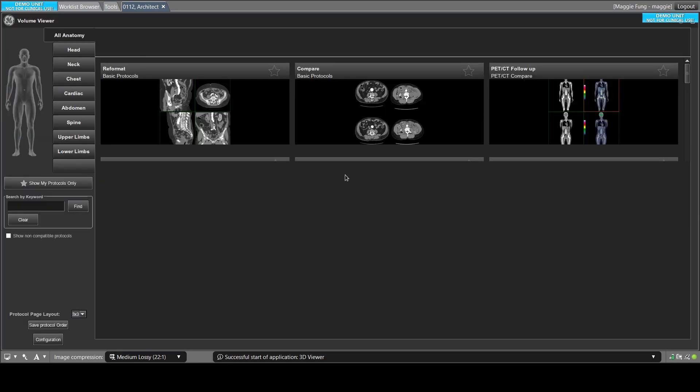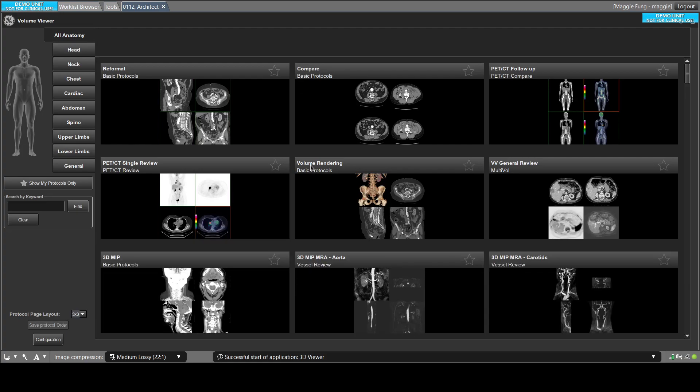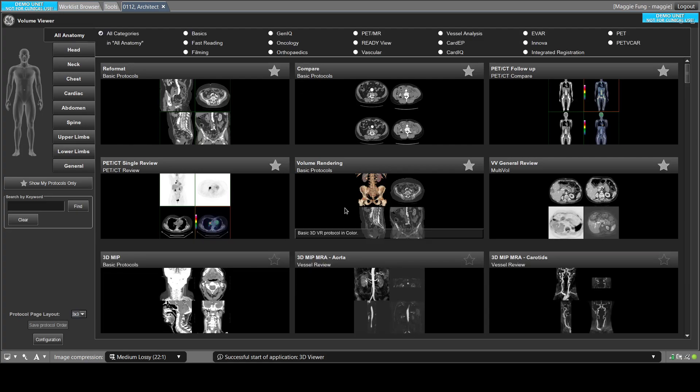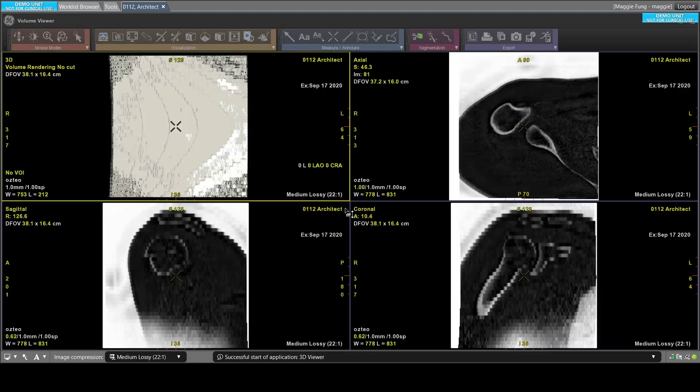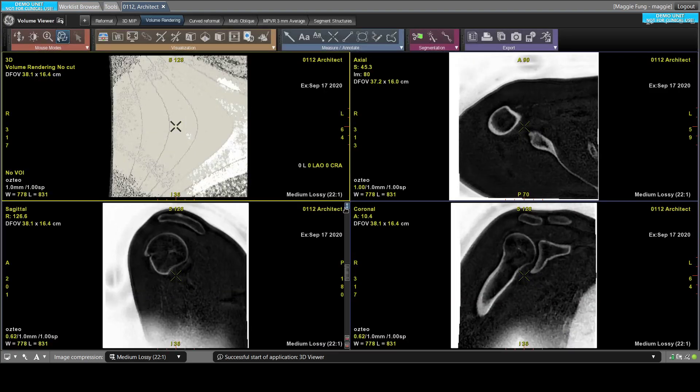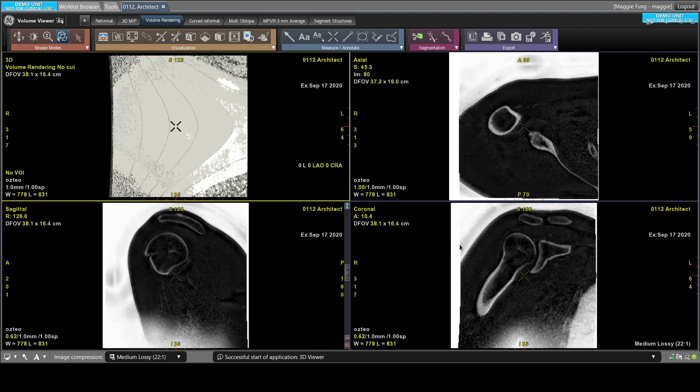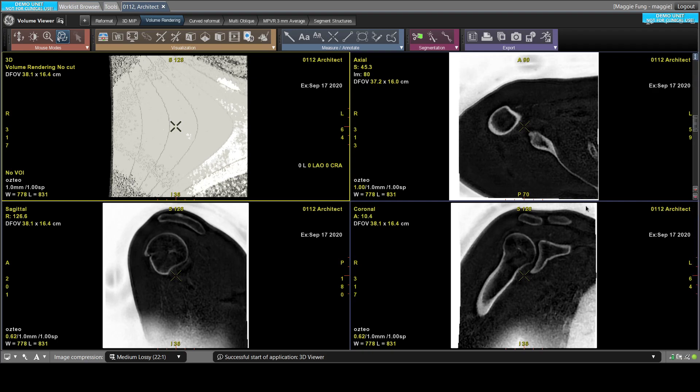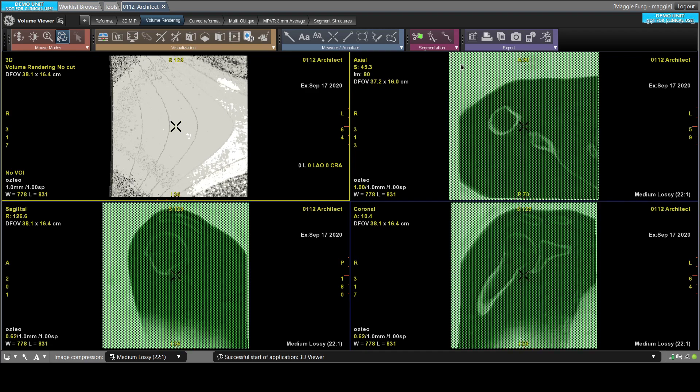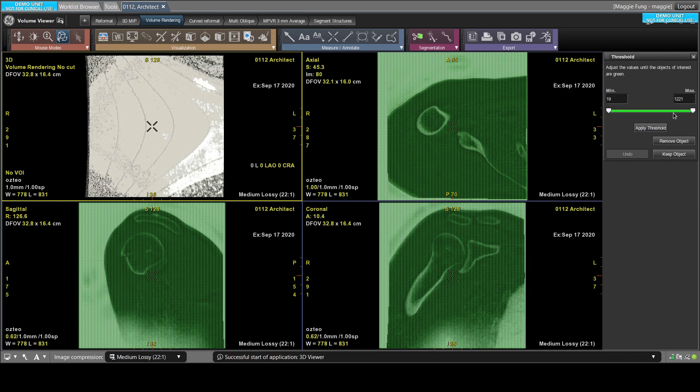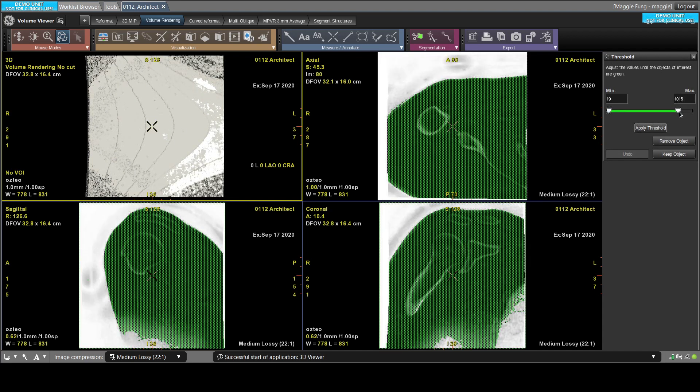So when it's loaded, you can choose your volume rendering basic protocols. The first thing when you get in here is you want to get rid of the air in the background. You can do that by going to segmentation, threshold, and adjust the maximum threshold bar.